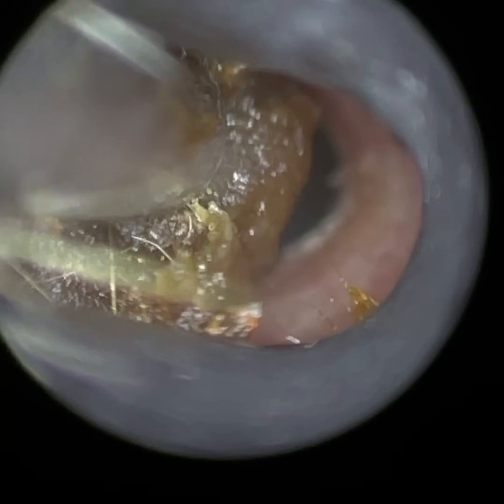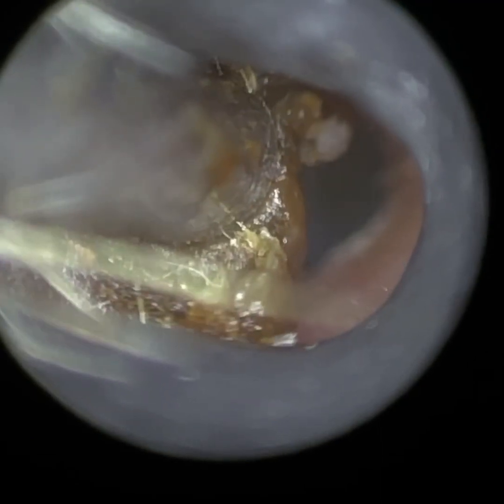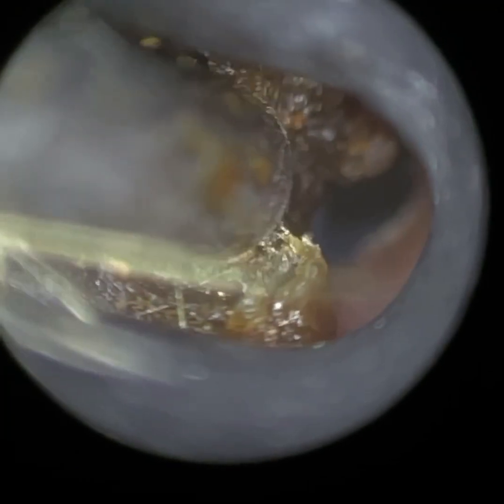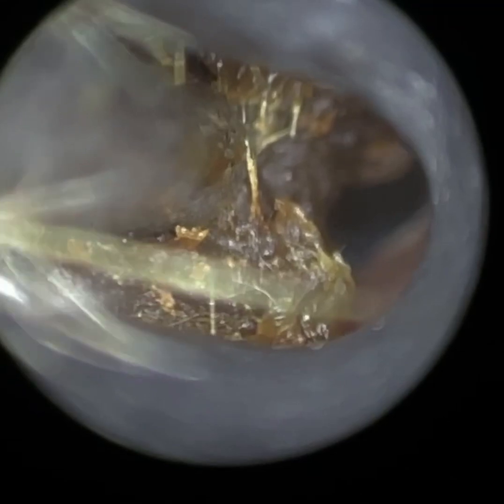This design provides several advantages. Having the slit allows more manipulation of the instrument, and it comes from a higher angle of incidence so it doesn't become blurry in view. Also, in terms of infection control, the suction probe is only making contact with the speculum.